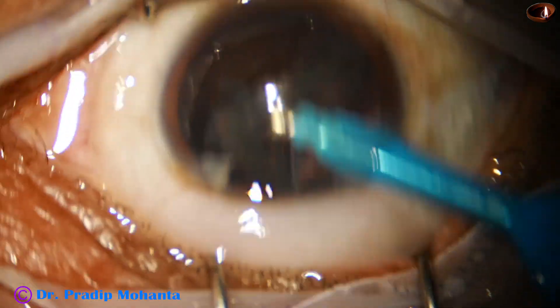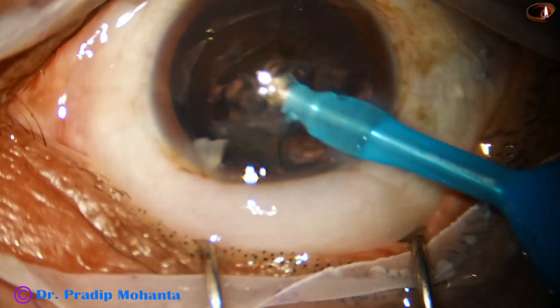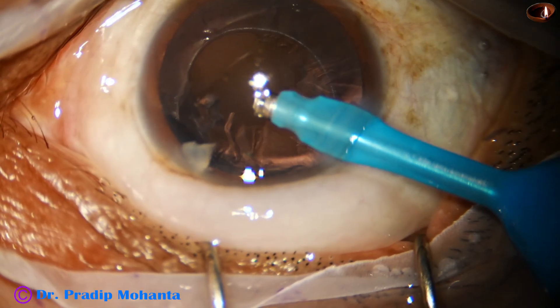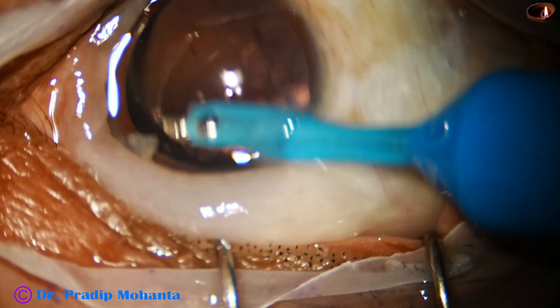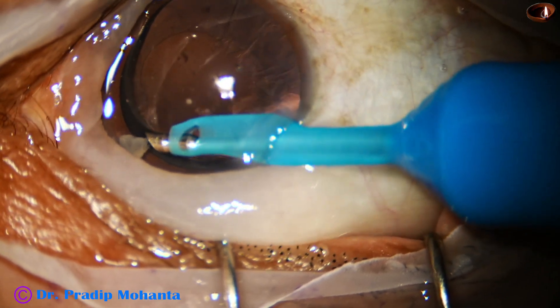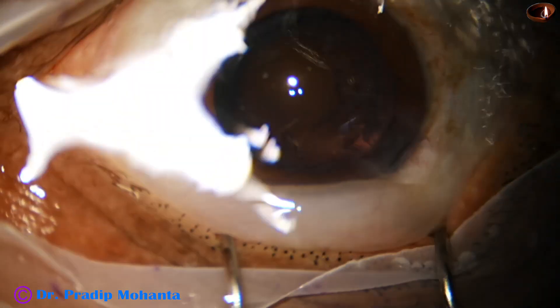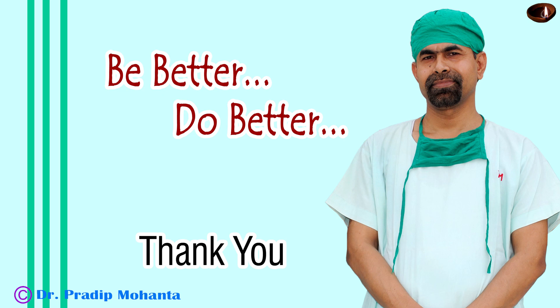She is very careful not to catch the posterior capsule and is always working within the central 3.5 millimeter safe zone. Now she tries to hold the small piece of nucleus at the side port and has done it successfully. A very nice job by my fellow — thank you very much for your attention.